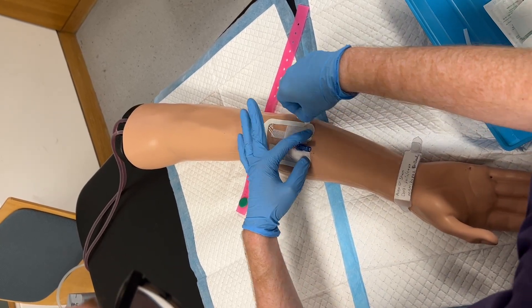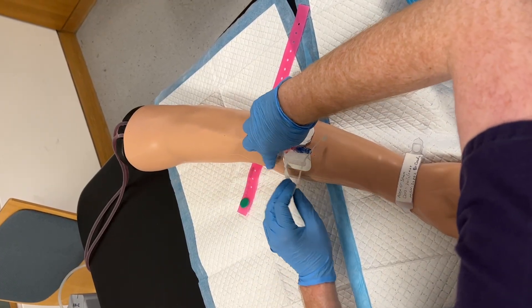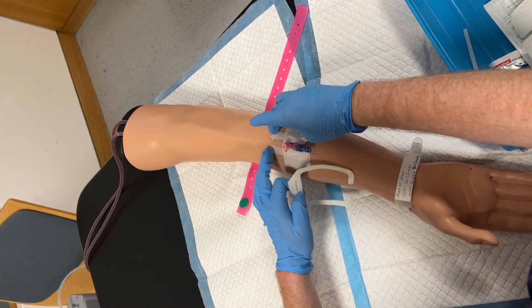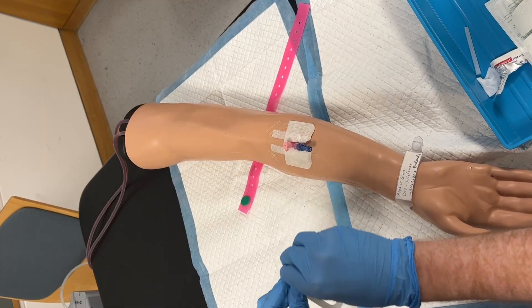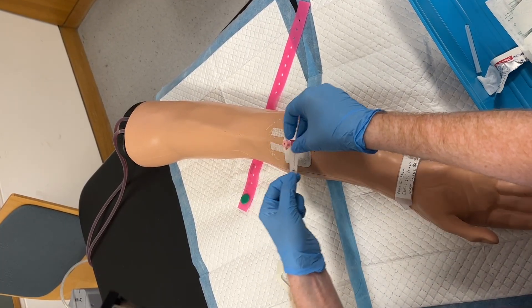If a dressing is put on incorrectly, this can later require removal, which can risk dislodging the cannula. It is important that the transparent dressing allows you to visualise the insertion site, so that this can be monitored for signs of infection.